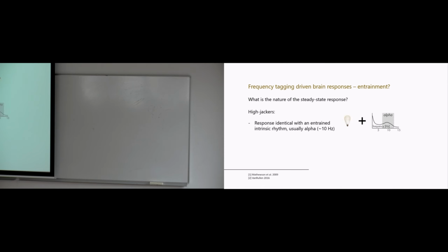And that means that we have, as an experimenter, control of the human alpha rhythm, right? So in the spectrum here, that typical 10 hertz peak, this is what we control now with our 10 hertz flicker. And why would you want to do that? That has something to do with how we think alpha works. So it is this waxing and waning phase of excitability in our visual cortex, for example, in a very simplified manner here.